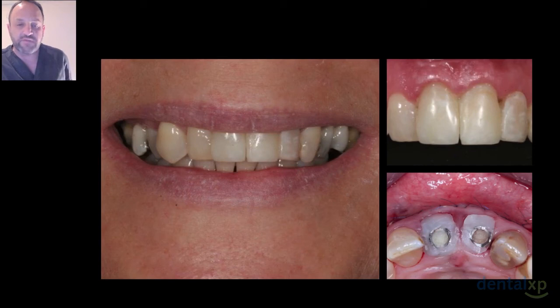And here you can see where a colleague of mine has created the provisionals, the soft tissue a little bit mangled after the provisionals have been put in place, and the interproximal area still needs to be opened up a little bit, because that papilla will fill in there nicely before we go for the finals, which will happen in a couple of months' time.